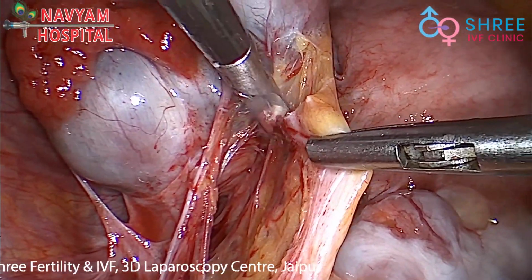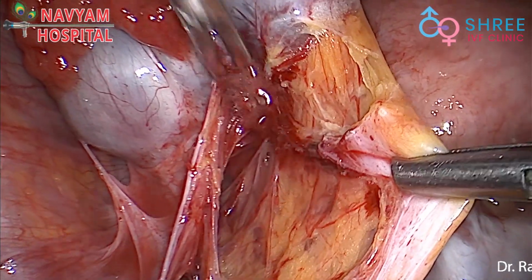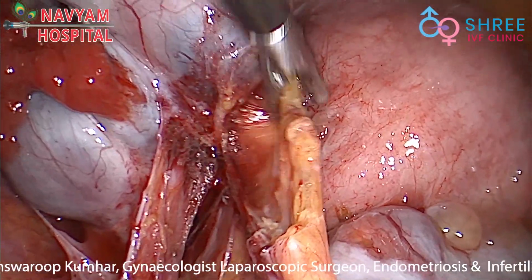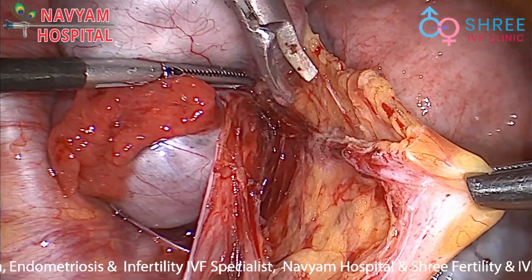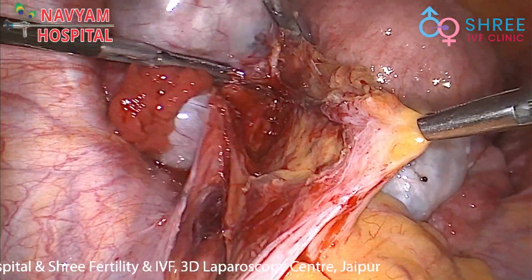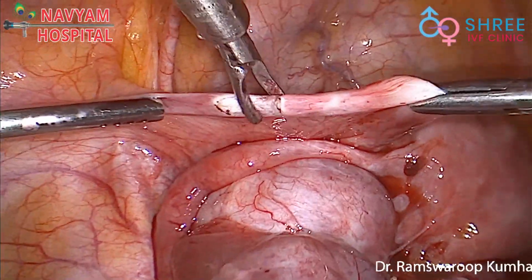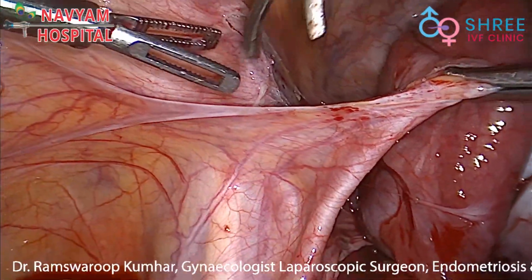Whenever we face bleeding or oozing, we have to tackle it at that particular time so that it will not spoil our field of dissection. After this dissection of the bowel, we have to dissect again on the left tubo-ovarian mass. So the further dissection on the left side was carried out, and for this we have now used the lateral approach to dissect out the retroperitoneal structures.